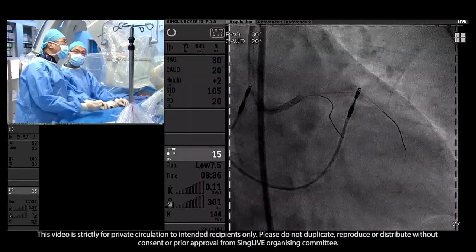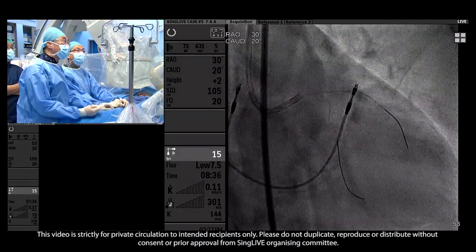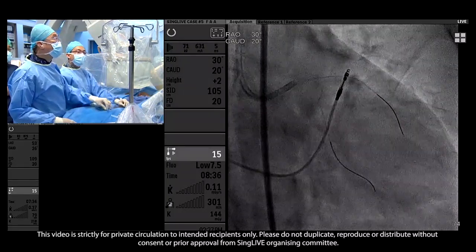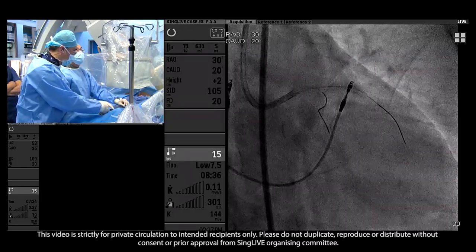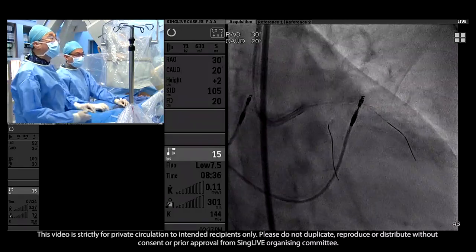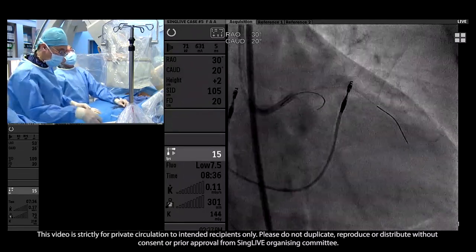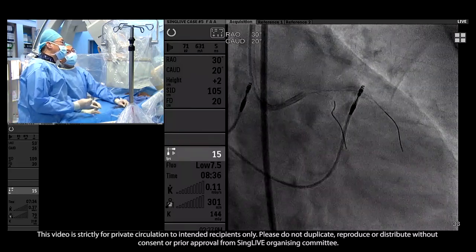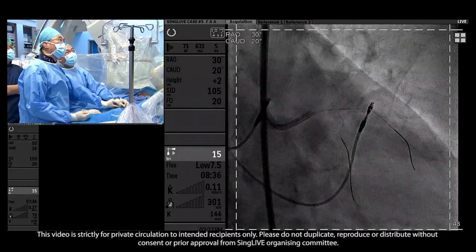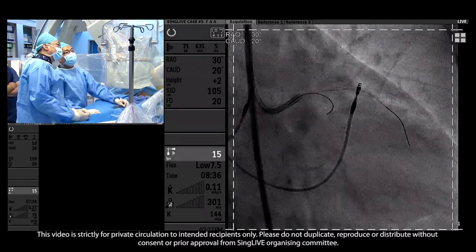I think I've changed my mind. I think the comments about the ease of drug-eluting balloons are fair. Maybe a little bit more modification of the circumflex ostium, perhaps with a cutting balloon or a Scoreflex, then a drug-eluting balloon, and then have a simple stent from left main to LAD. I think she's 80 years old. So we don't need to get a perfect result. So maybe Scoreflex and drug-eluting balloon, and then a single stent.